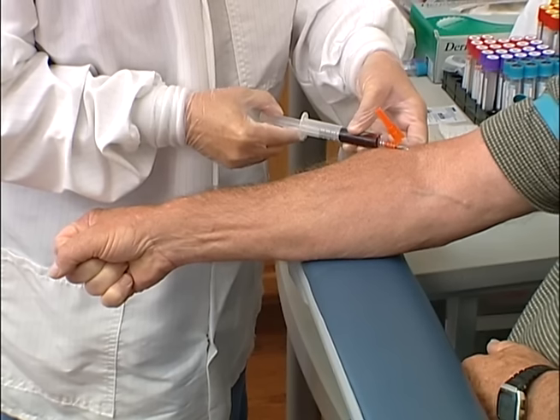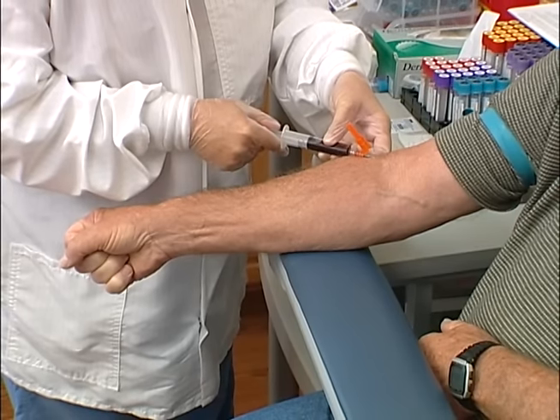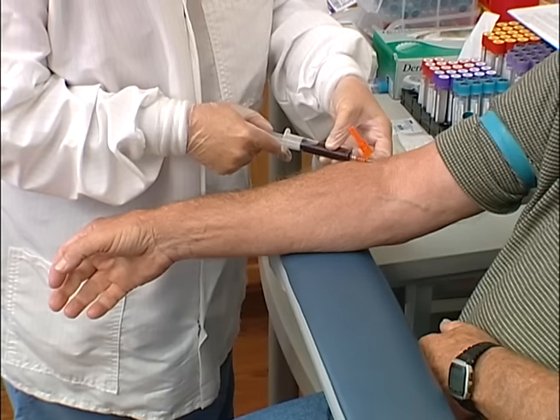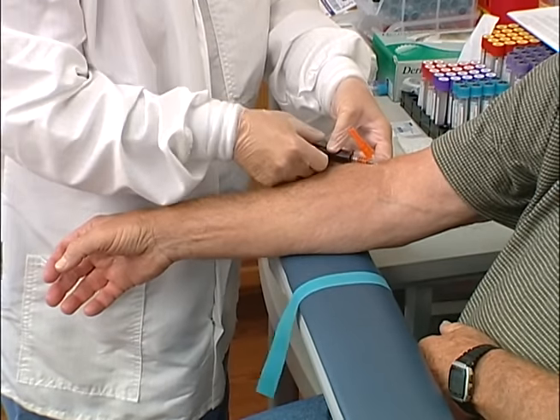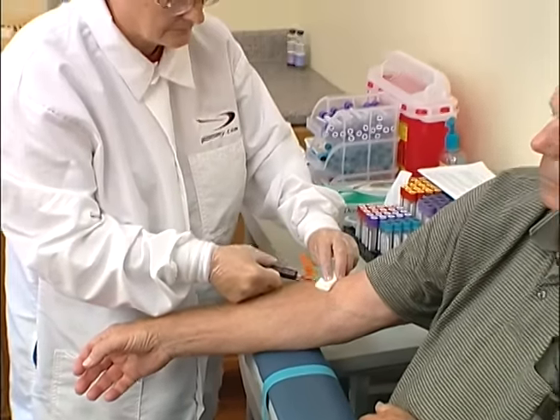Release the skin and withdraw the plunger without disrupting the needle by pushing against a flared wing of the syringe as you pull back on the plunger. When enough blood has been obtained, have the patient open his fist, release the tourniquet if it has not already been released, place a clean gauze pad over the insertion site, remove the needle and apply pressure.